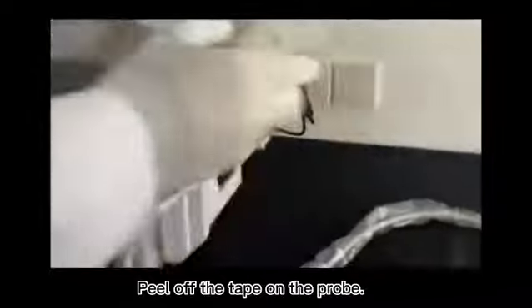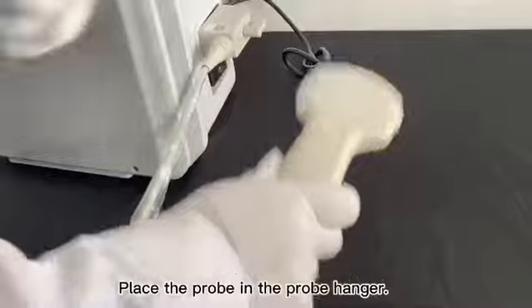Peel off the tape on the probe. Place the probe in the probe hanger.